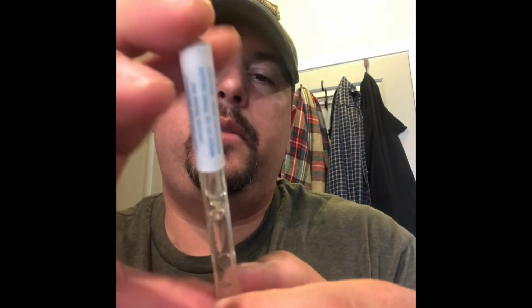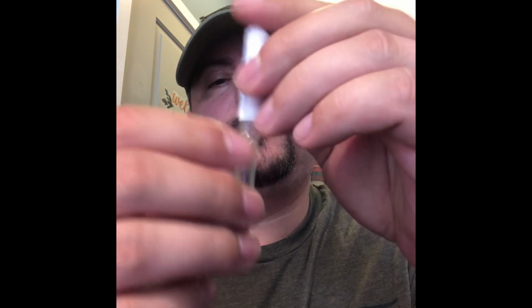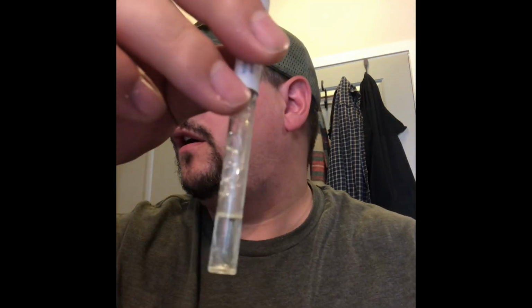But now let's test the marijuana. We're gonna break one. Let's shake it around a little bit. Nothing. These, I believe, have to turn like a brownish color. Like I said, I only have two of these.